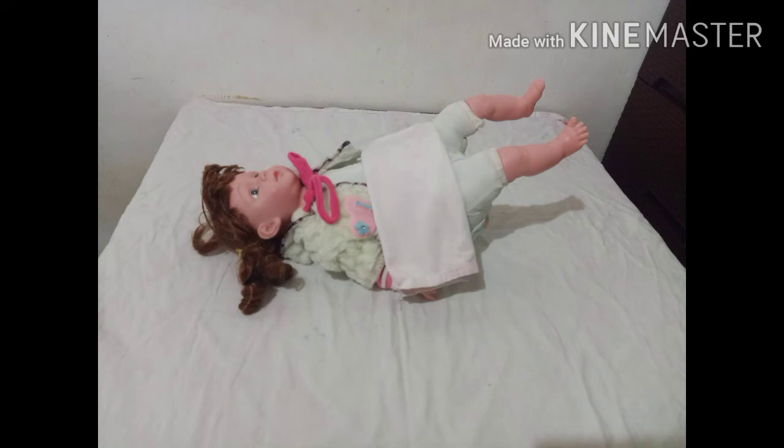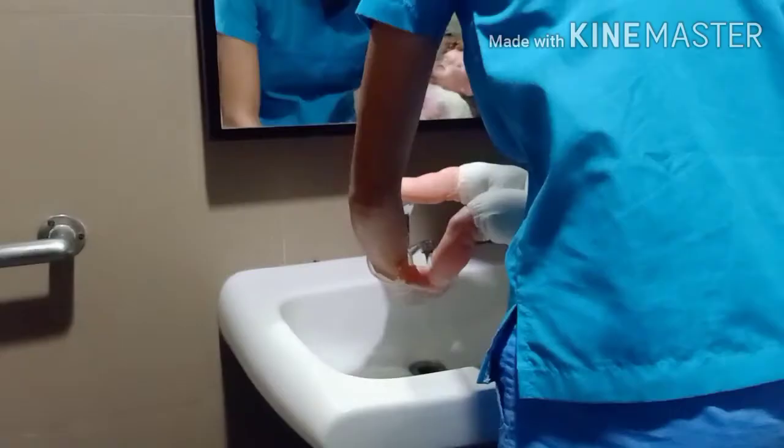Provide privacy, for this avoids unnecessary exposure of body parts. Then wash perineal area thoroughly with soap and water as needed. This is because washing ensures that the area is not contaminated before putting the wee bag.